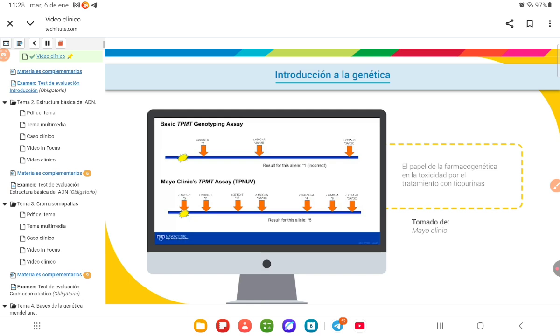In contrast, in the assay on the bottom, the allele was detected and the patient was correctly assigned to STAR1, STAR5 genotype and an intermediate activity, and therefore probably would have received a reduced dose.